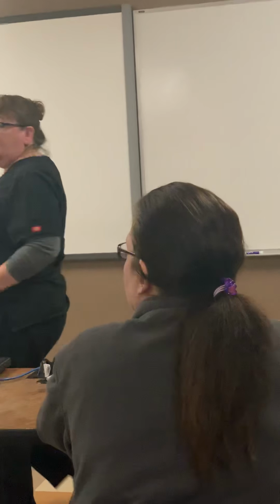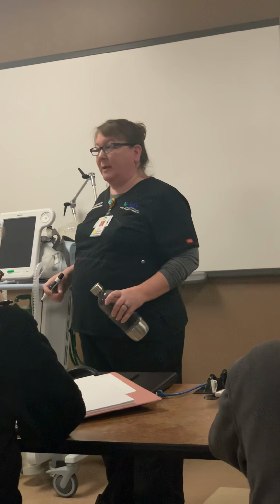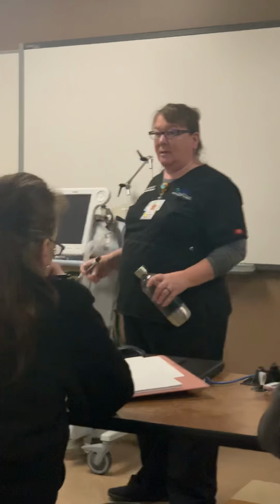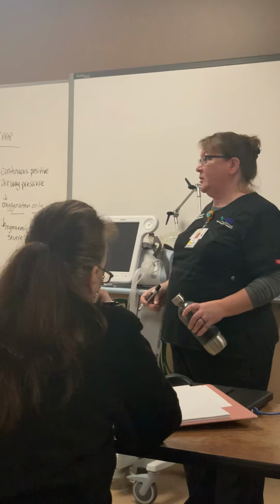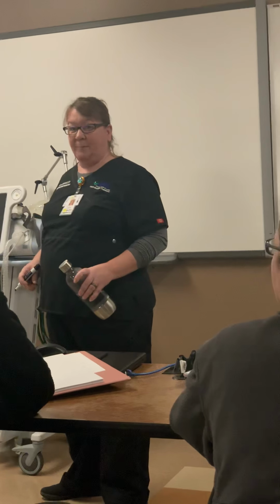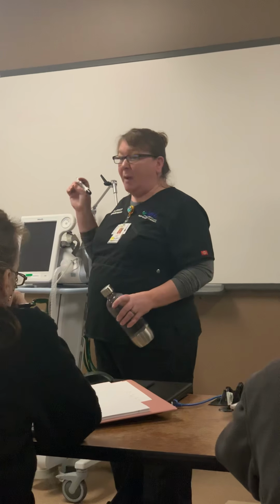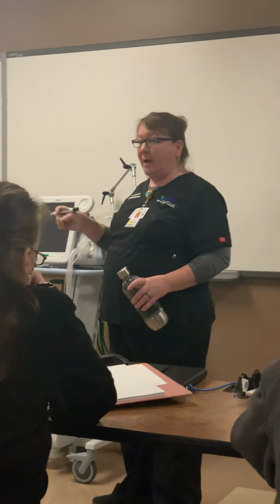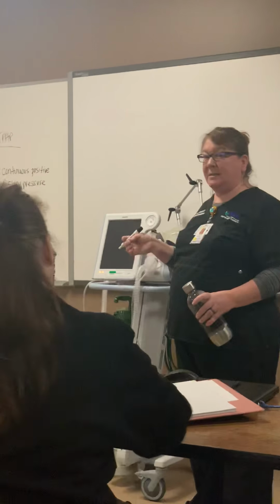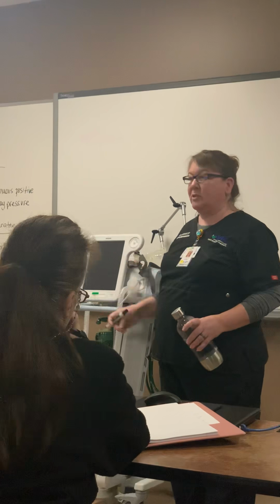And if you have to, you're going to get your clinical supervisor, you're going to get the educator, you're going to get the manager of the department. It's a high risk. You're putting your patient at risk. You're putting your license on the line. Do not do it. Tell the doctor if he wants that patient to be on BiPAP, he will have to do it himself. That's one of those times you have to stand your ground because it's totally inappropriate. If your patient's in a very closely monitored environment and they're restrained, or they have a sitter in the room, that's okay because somebody's there. I'm talking about leaving a patient in the room by himself on a BiPAP with restraints.